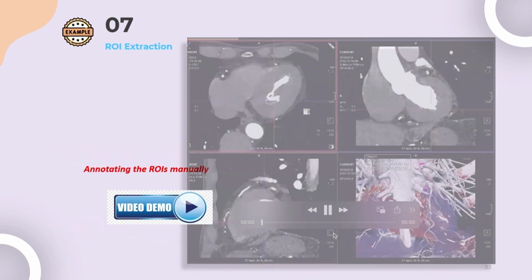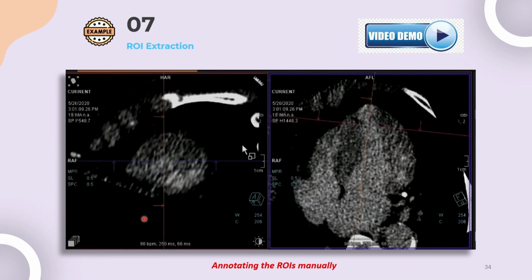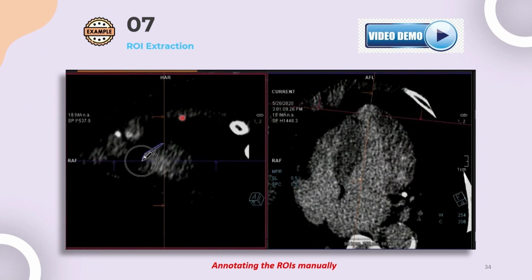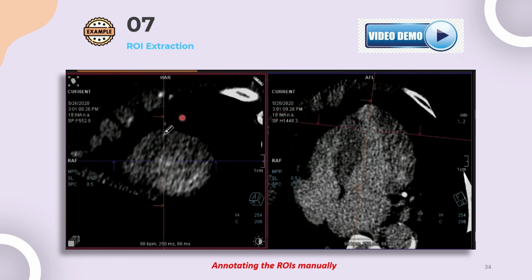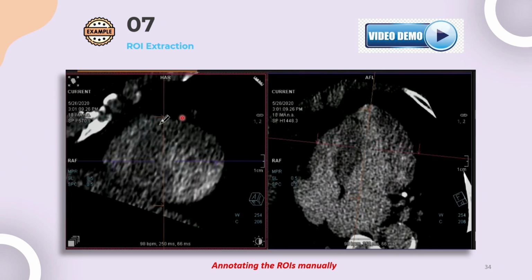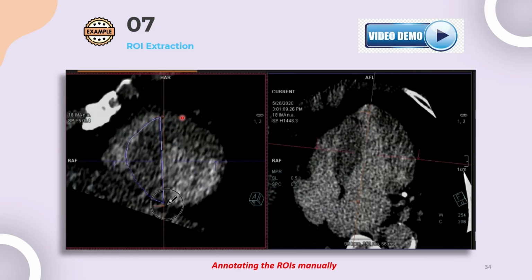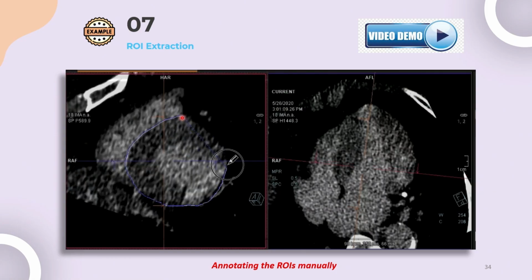Another demonstration is to highlight the left ventricle. I will first highlight the left ventricle, and then in the second part I will highlight the blood inside the left ventricle. In the end, the first part minus the second part gives the myocardium, which is the heart tissue within the left ventricle.